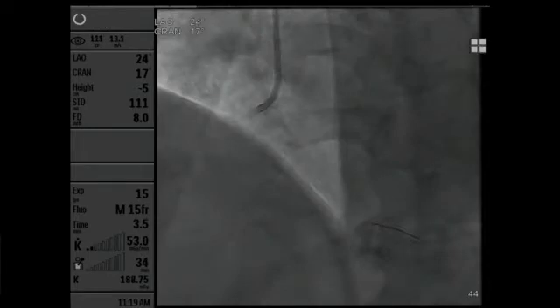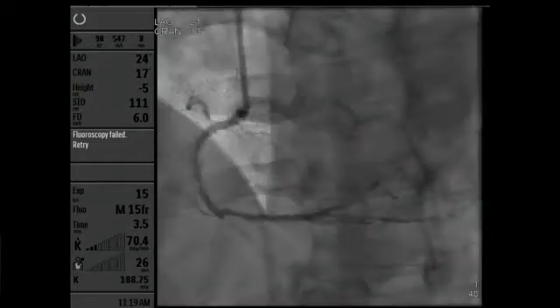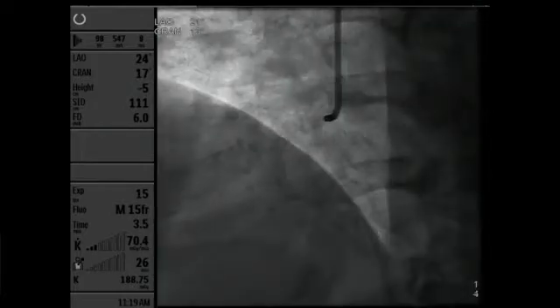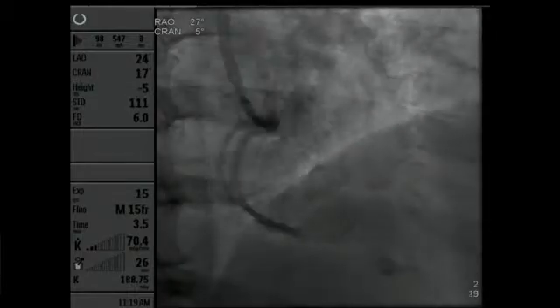Yeah. So I'm using a left radial approach. I know his right radial approach is quite tortuous from prior footprints from prior colleagues and interventionalists, so I elected to go left radial. We have a 7 French Judkins Right catheter, and I have a run-through wire down the right coronary artery extending to the PDA now. And we also have Dean Kyriakis and Richard Schlomfitz on the panel. This is the first shot from today: the mid-right coronary with high-grade disease. And this is the RAO of that.